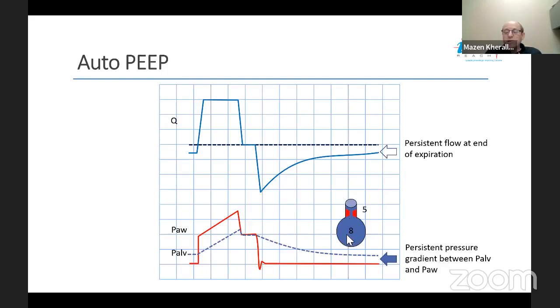This way, look at this patient here. He's got auto-PEEP of 8. The PEEP is 5. He needs to create a gradient in order to inhale, and he needs to drop the alveolar pressure to 2, and that means that he needs to provide -6 of decrease in the pressure. If you add 3 more centimeters of PEEP, we equalize this, and all what he has to do is just drop the pressure from 8 down to 5. He would need to do only -3 centimeters of water.